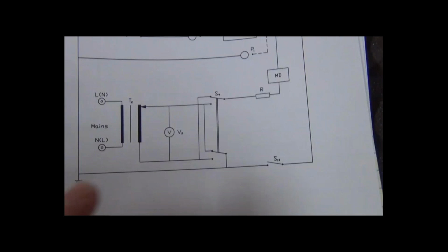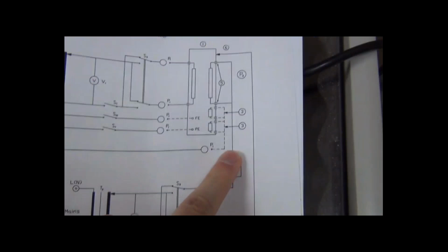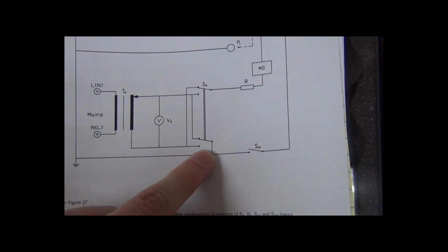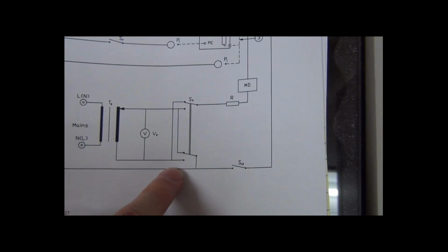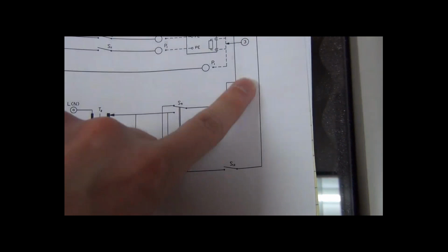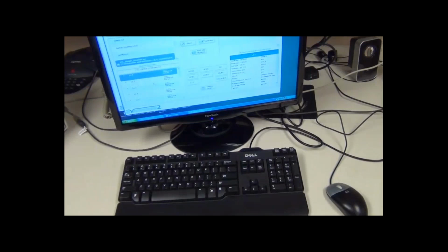So here we can see T2, and we have line, neutral, going through a resistor, through the measuring device, and back up to the patient lead. At the same time as running line through this resistor, I need to tie neutral in to my protective or reference point. So by putting them through 2 separate scanners, I have the capability of tying these points together without including it in the measuring circuit. So that's why I've used 2 scanners in this instance, essentially to provide isolation.